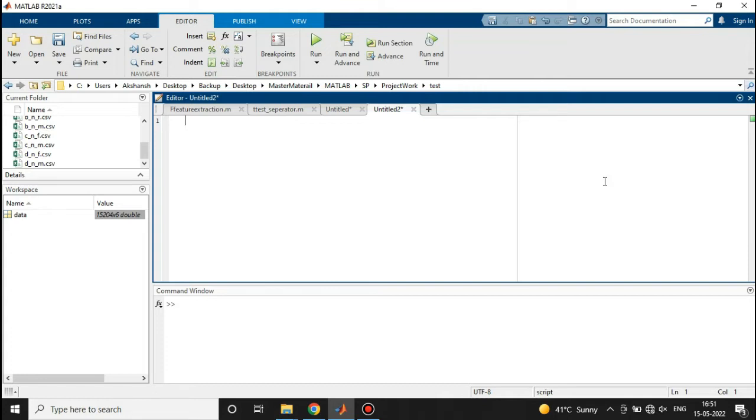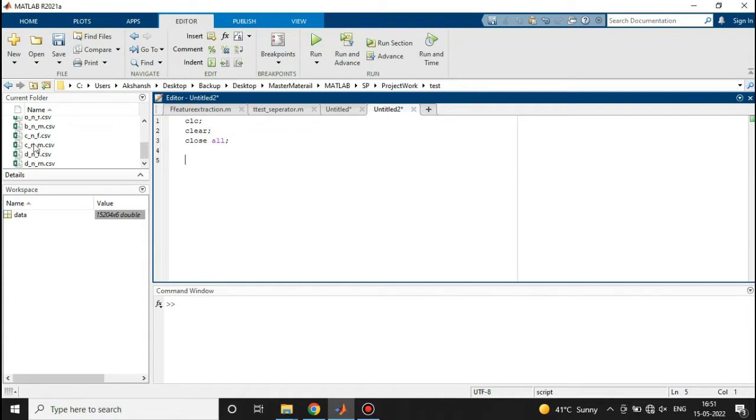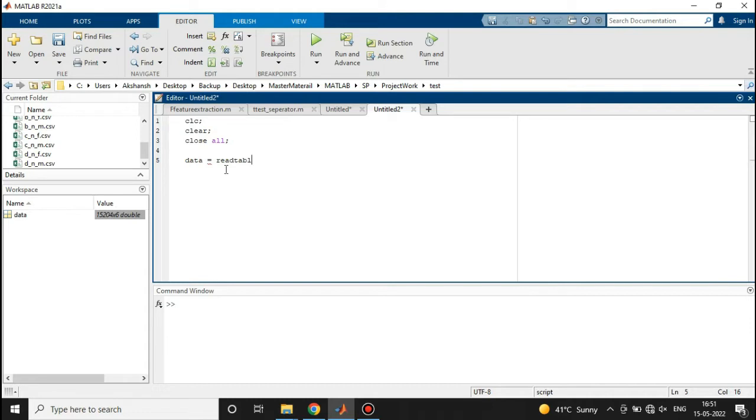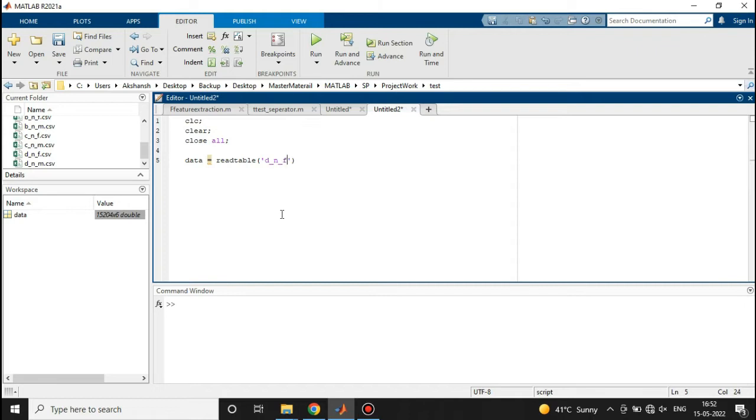First of all we have some basic commands in MATLAB that I'm writing here. Now I'll read the data from any of these files. I'll name the data as 'data', and to read the data, as this is a table, we'll use the command readtable. Inside the inverted commas we will write the name of the file. Let's read this file d_n_f.csv. Let's run this section.